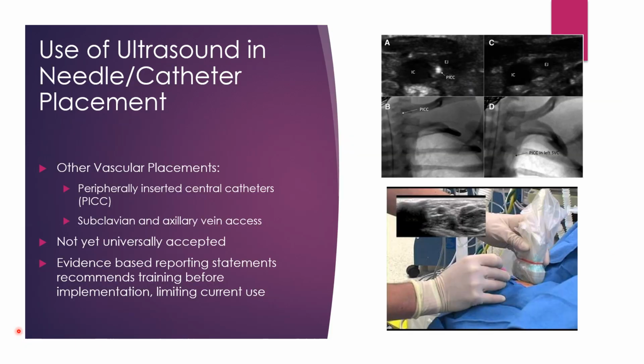So when it comes to the actual procedure, as I mentioned, a little bit of training and a lot of practice is going to make this much easier. There is a lot of hand-eye coordination involved in this process. For instance, we actually have a phantom, making it possible to get some of that practice in before you actually have a patient. If not, you can create different phantoms in your own site that might help you with this.